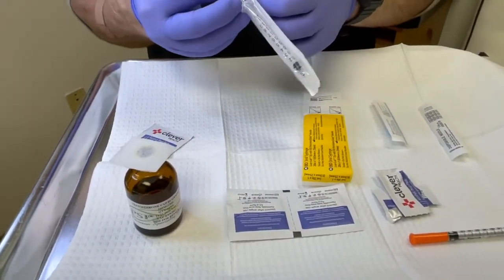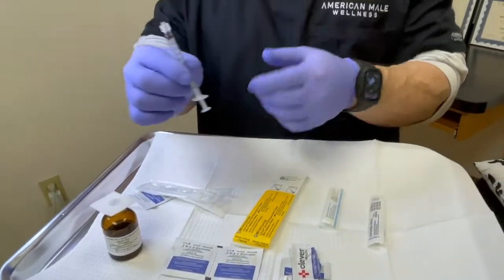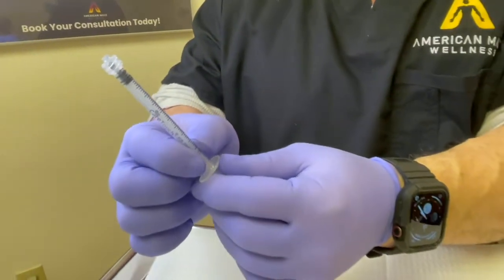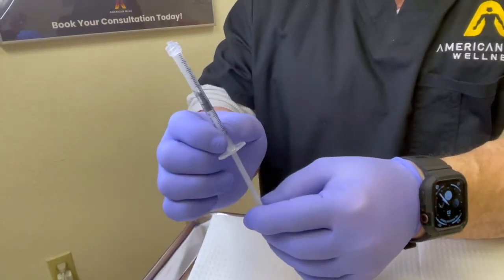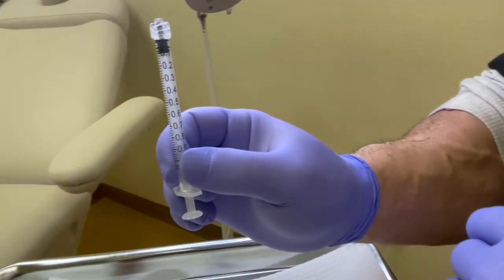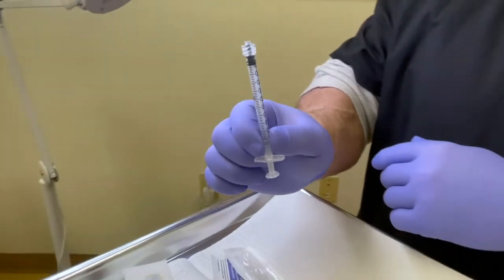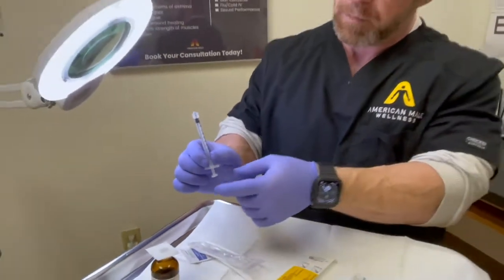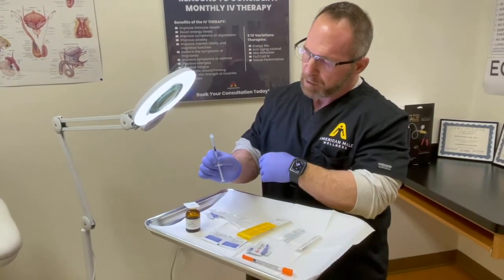I'm opening both packages. This syringe is a luer lock without a needle, goes to 1ml. I use the smaller syringe for micro-dosing — anything under 1cc. The testosterone we're using today is concentrated at 200 milligrams per ml, so a 100-milligram dose would be 0.5ml.